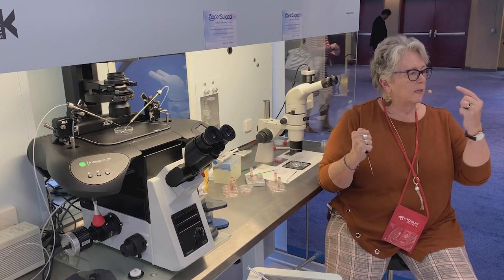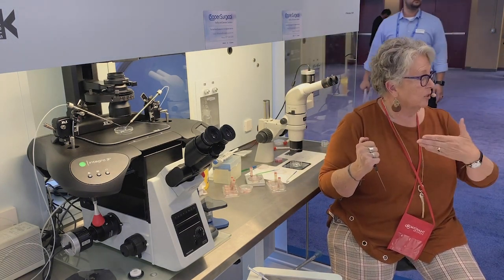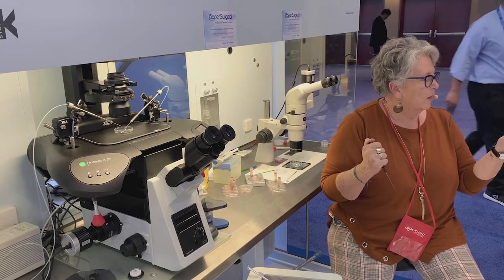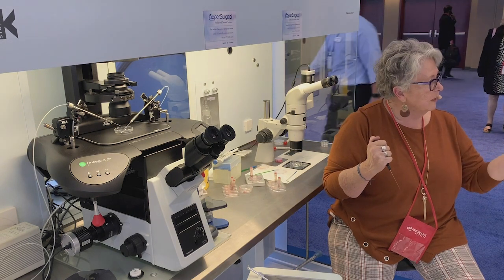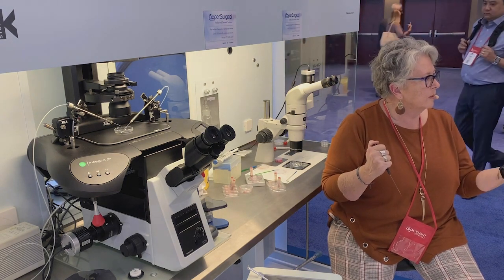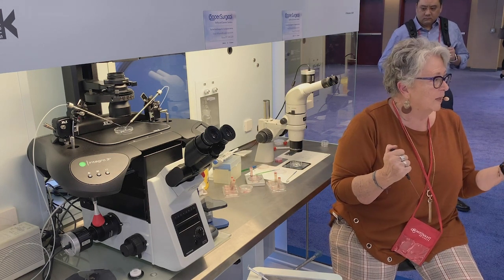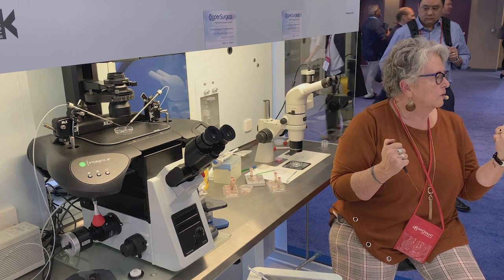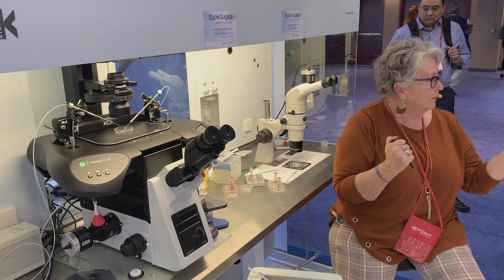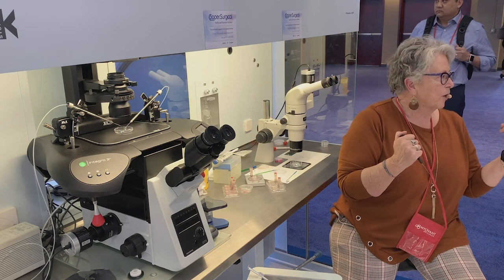So there's the bead. It's in the bottom. I had to go find it a bit because this solution is so thick and so viscous. The bead even floated. So you have the same problem when you're working with your embryos. They're going to float around on you, so you have to watch them, follow them, see what they do. You'll see that in the vitrification solution, they'll shrink up very, very tightly, which means they become a little more visible to you. But the beads aren't going to do that.